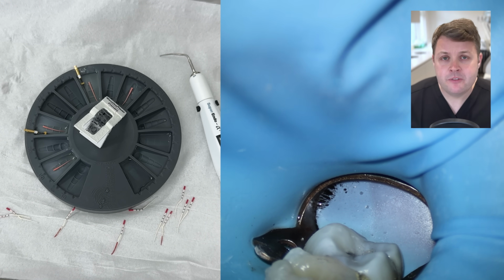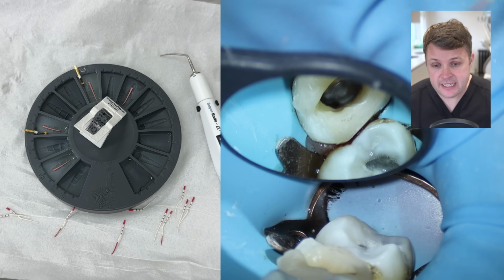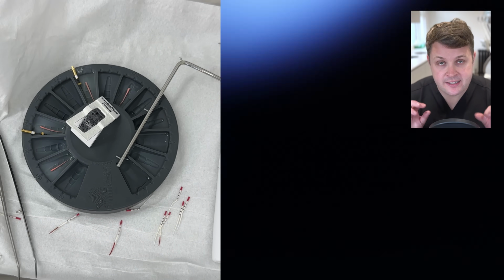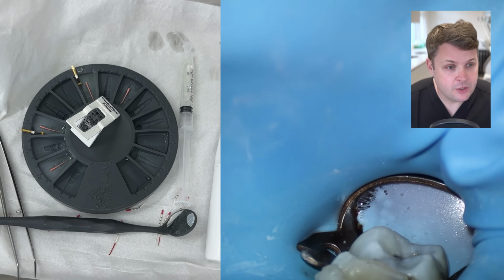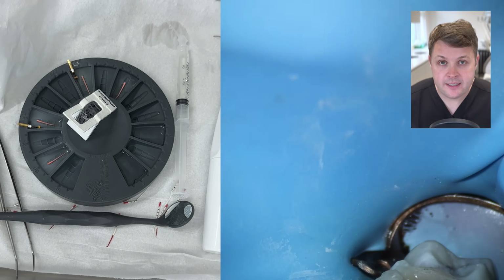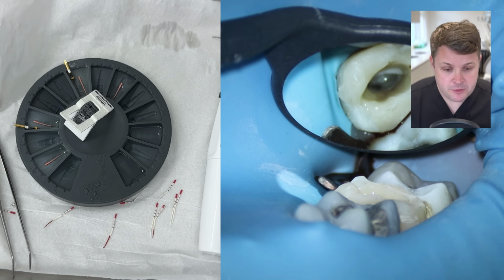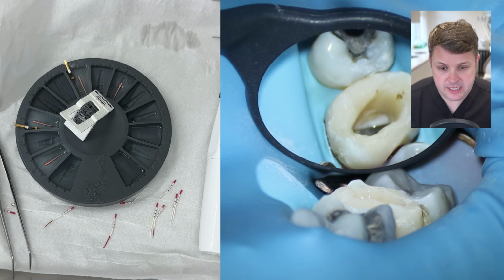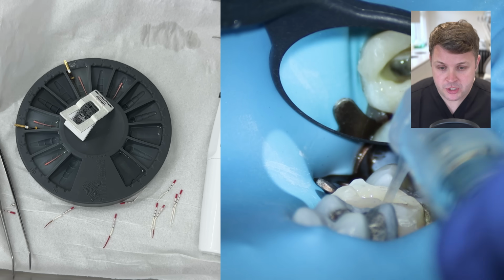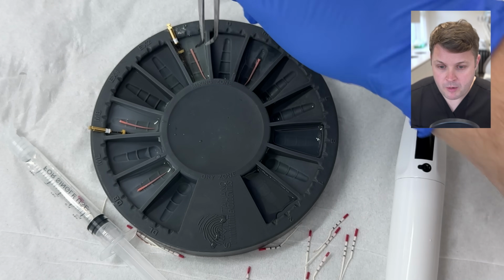A lot of people have mentioned to me that sometimes if it bleeds and I get it to stop bleeding and then I obturate there, we're worried about the residue of the blood on the inside of the canal. Does that affect the sealer, the sealing of the canal space? So I go back with my irrigation protocol, I give it a bit of a clean out, and I go back in with the paper points. I'm very mindful now of how far I'm pushing them in, and I've noticed now the canals are all nice and clean. So we're now ready to do our obturation.